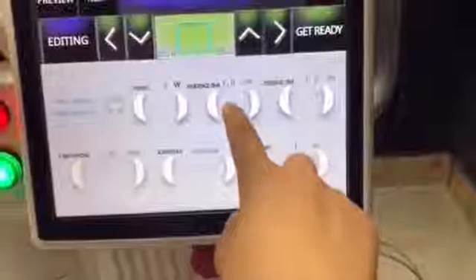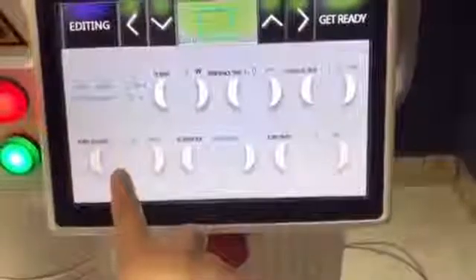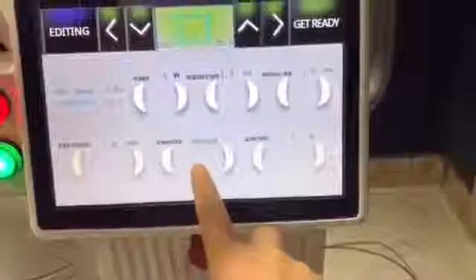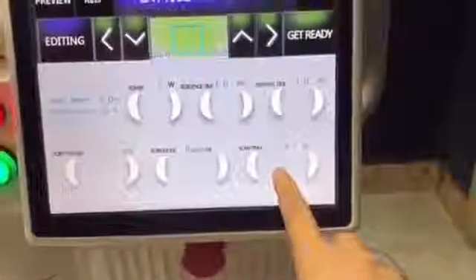Residence time: 1. Interval time: 1. Point space — meaning the distance between each point — set to 1. Scan mode: random will reduce the pain. Scan times: 1.